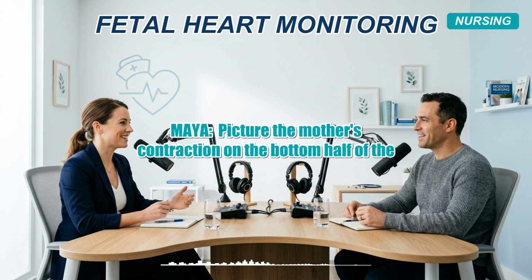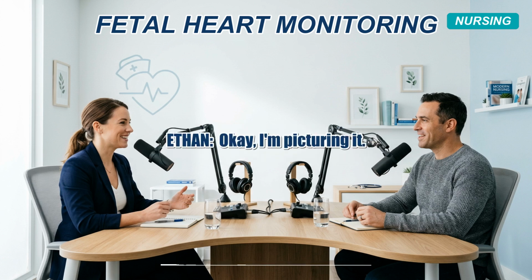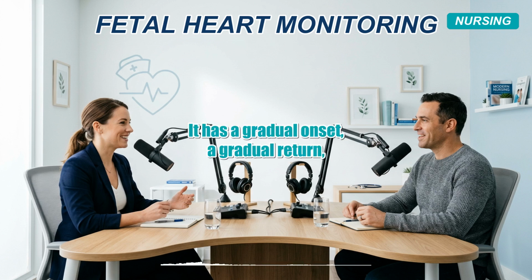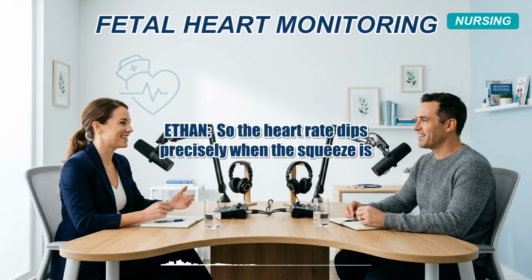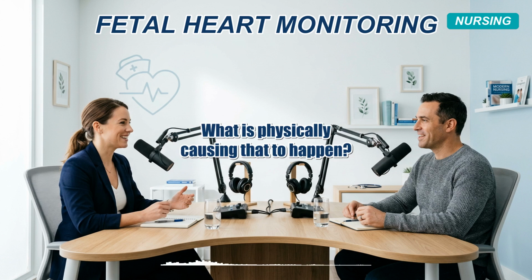Picture the mother's contraction on the bottom half of the screen as a smooth rolling hill. Okay, I'm picturing it. An early deceleration is a perfect, smooth mirror image directly above it. It has a gradual onset, a gradual return, and the lowest point of the baby's heart rate, the nadir, lines up exactly with the peak of the mother's contraction. So the heart rate dips precisely when the squeeze is the tightest. What is physically causing that to happen?